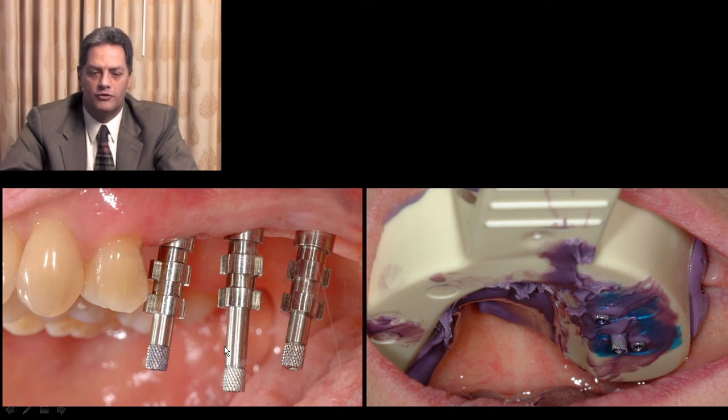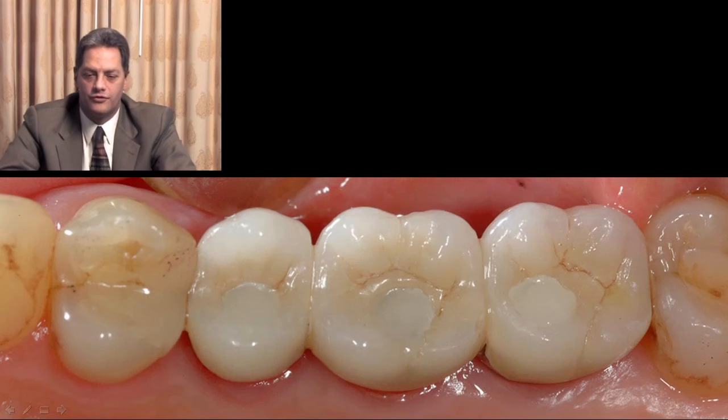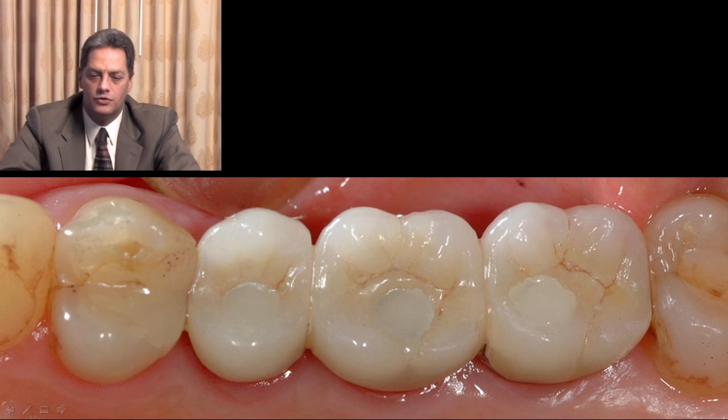One of the previous studies was talking about connecting the implants. This could be through a ligature wire from orthodontics and a resin such as a GC resin pattern. And once the material has set, the impression posts are actually retrieved and the impression copings are embedded into the impression. Easier transfer and more predictable, since there's no need to reposition that impression coping onto the impression.